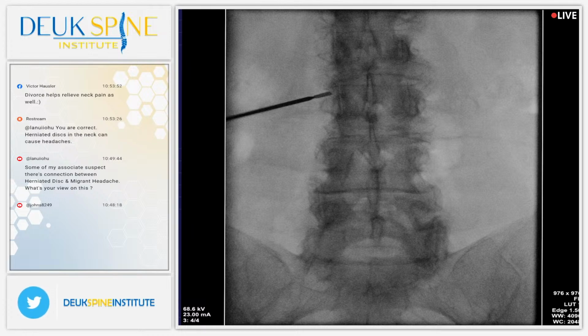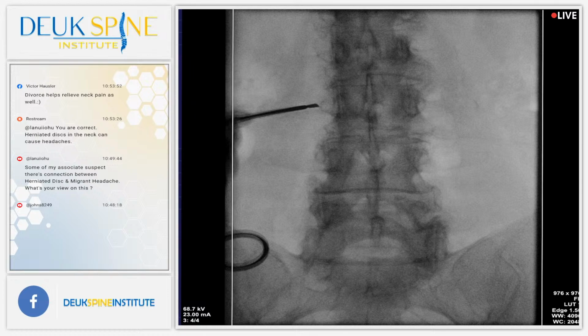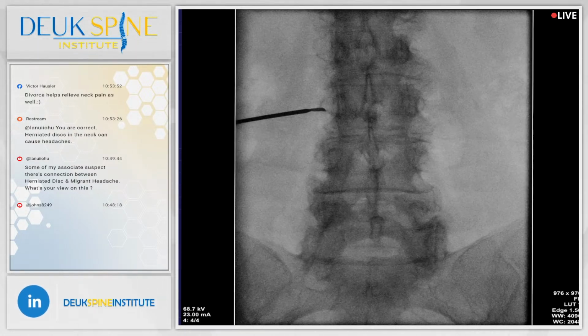If you look at the x-ray there, show the audience where the transverse process is. The tip of my probe is sitting right on top of the transverse process, right where that pain nerve lives. So by going here and destroying the pain nerve, called the medial branch of the dorsal ramus, I will eliminate her facet pain once and for all, which is a good thing.